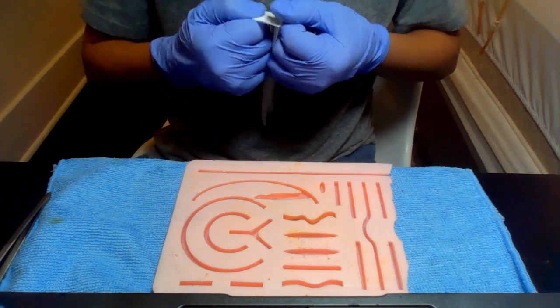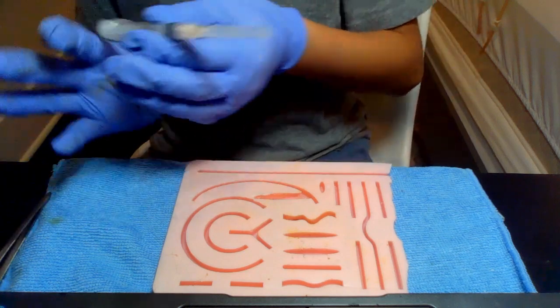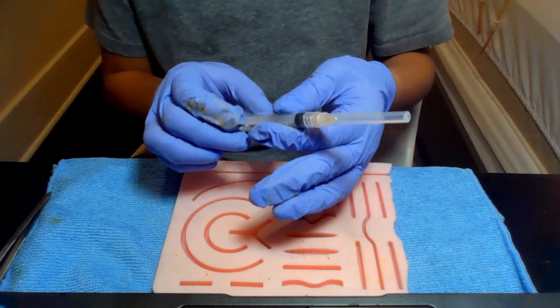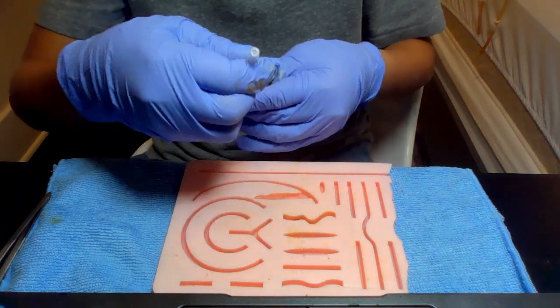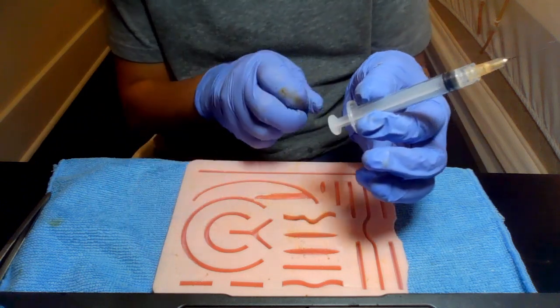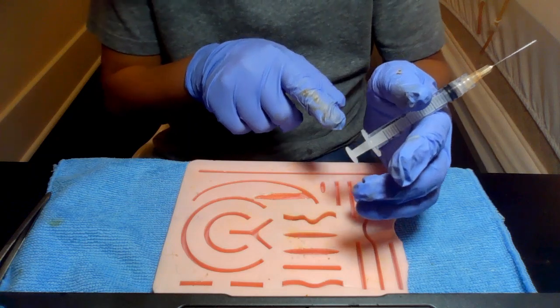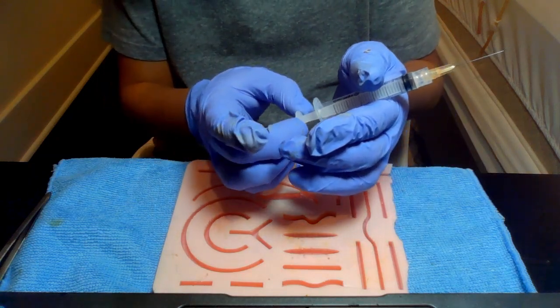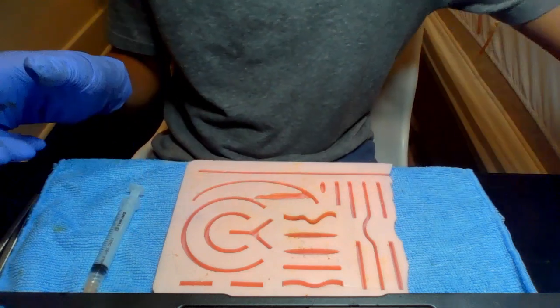So now we're going to take our syringe. A tip with the syringe whenever you're using one: take off your needle cap, make sure the needle is secure, and make sure that we don't grab this part right here. Let me get my glove a little straight. We want to grab just right here because we want to leave that a sterile area. So we're going to set down our syringe.